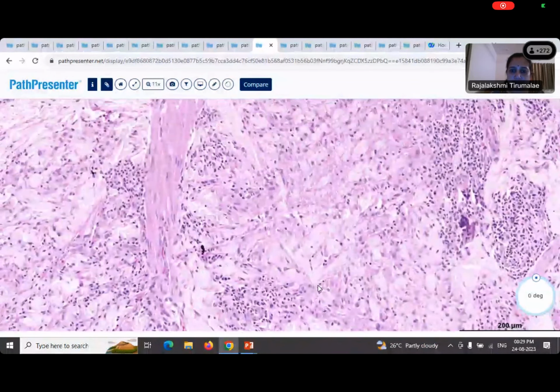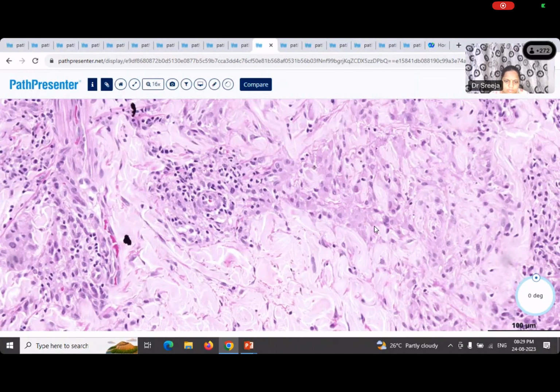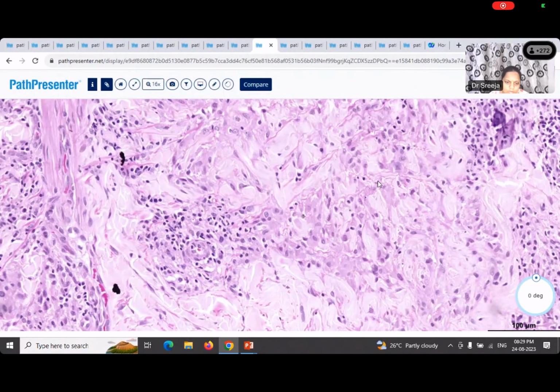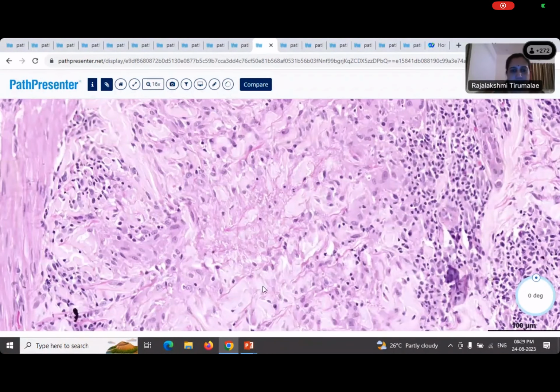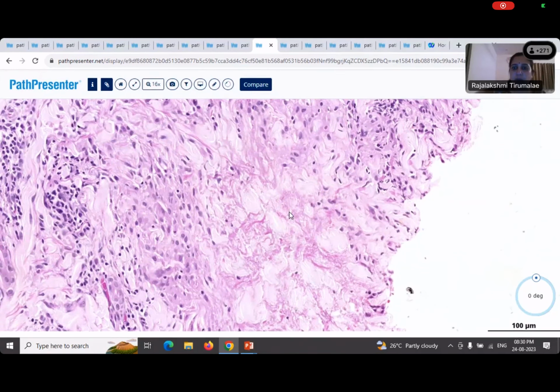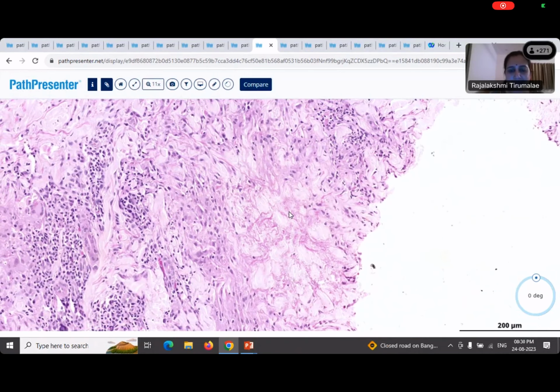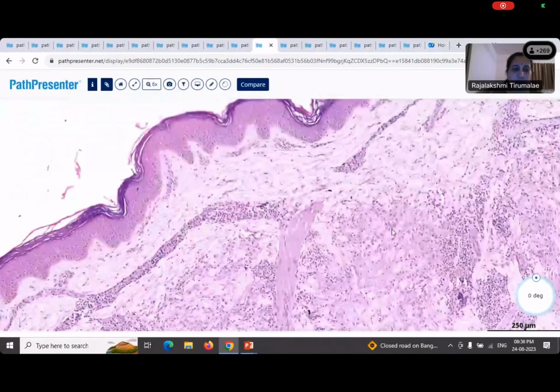Okay, so what is the composition of the infiltrate? Lymphocytes, ma'am. Okay, what are these cells? Histiocytes. Lymphocytes as well as histiocytes. And what's at the center? What is happening here? Degraded collagen. You're right. I think it's better to use the word altered. Necrobiosis is the term that I'm trying to avoid, because it doesn't make sense to me. I prefer to use the term altered collagen. Sometimes it has a more eosinophilic hue, and more often than not, it appears slightly basophilic. This slide is a little lightly stained, so you're not able to make out the basophilic hue. So let's stick to the words altered collagen. You have altered collagen around which you have these histiocytes and lymphocytes.